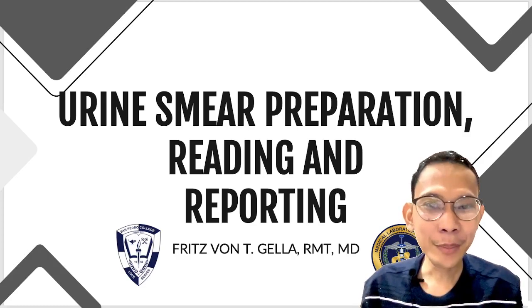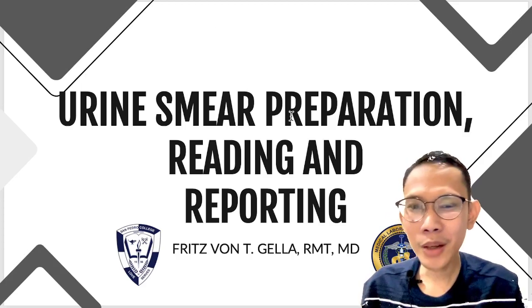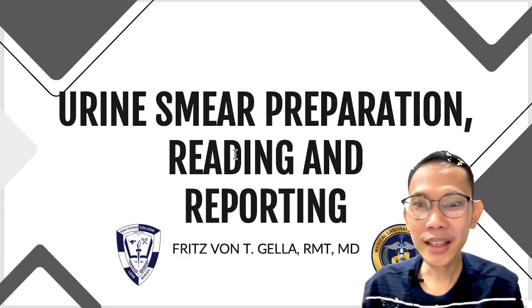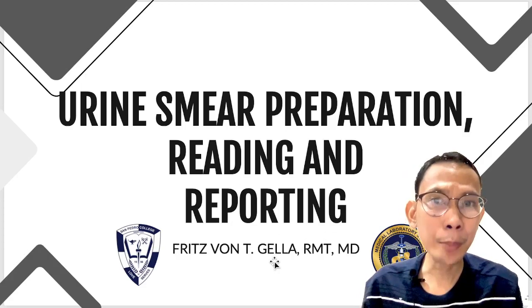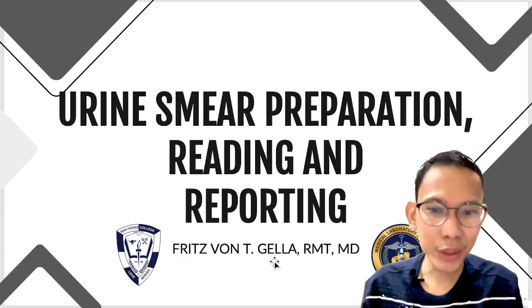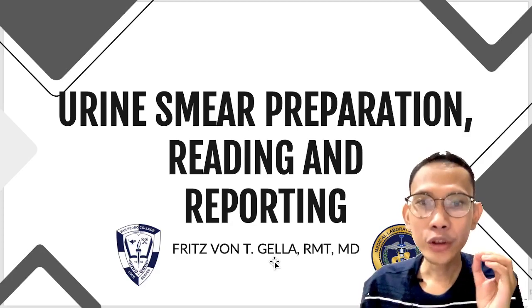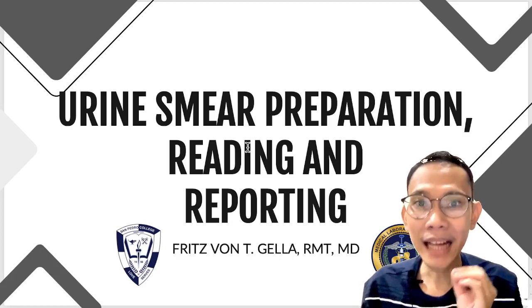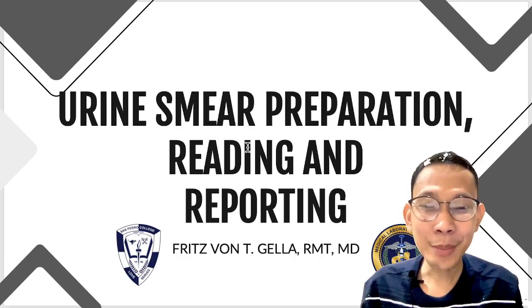I know you already heard the news about your limited face-to-face finally. And you know what? This topic will be easier to discuss when we have a practical examination, because it's a lot easier. You will really understand how to properly read and how to properly report when you are using your microscope and doing the actual urinalysis. But for now, just try to understand so that during our limited face-to-face, we will still discuss this, but somehow you already have the idea. Okay? See you, hopefully next month.